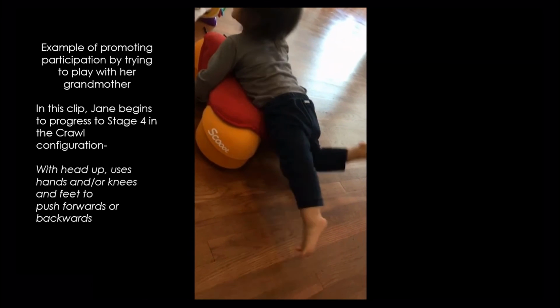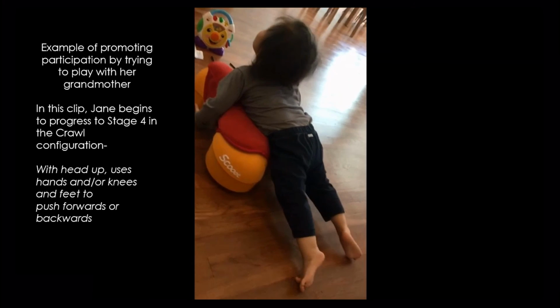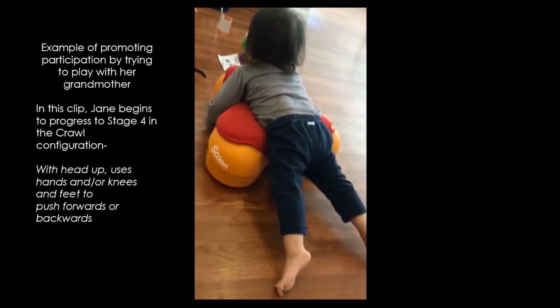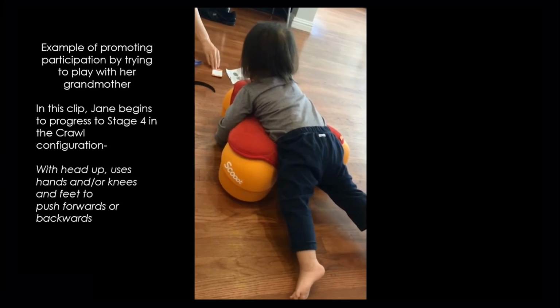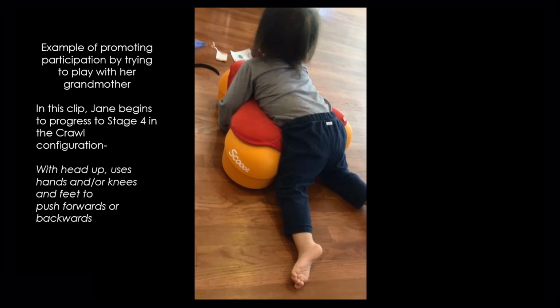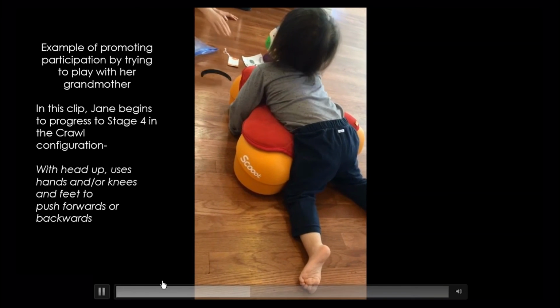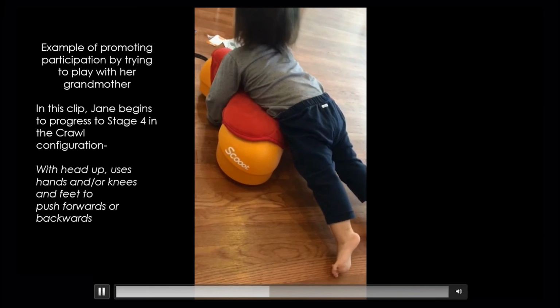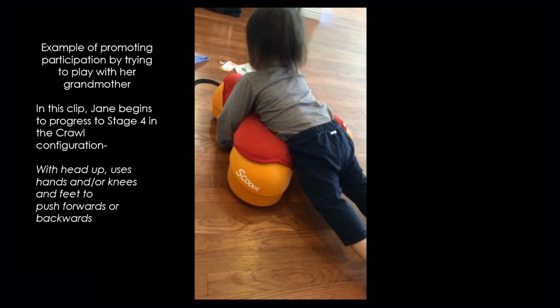But you can see how it places her nicely to put her knees on the floor, almost on the floor, and then her hands on the floor to try to move forward. Did she like being... she seems like she's sort of enjoying being in that position as well. Yeah, they really like this crawl and the ride position, and they're always changing them back and forth for her. They really enjoy both of them. So she's very comfortable in the crawl position.